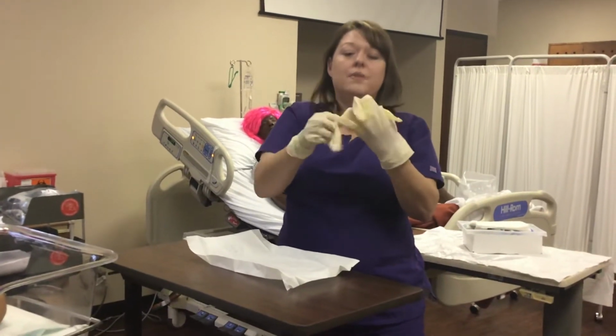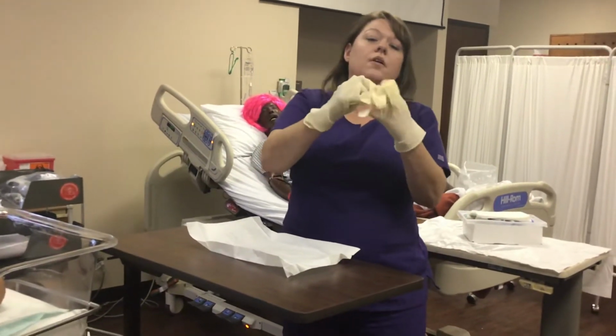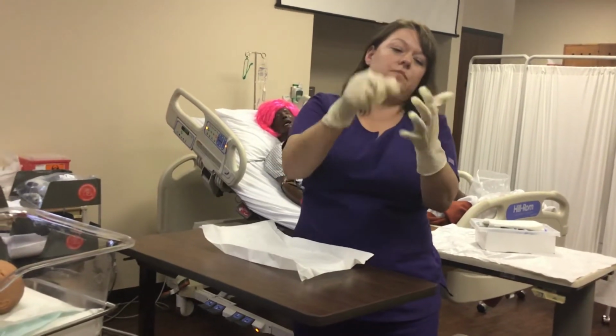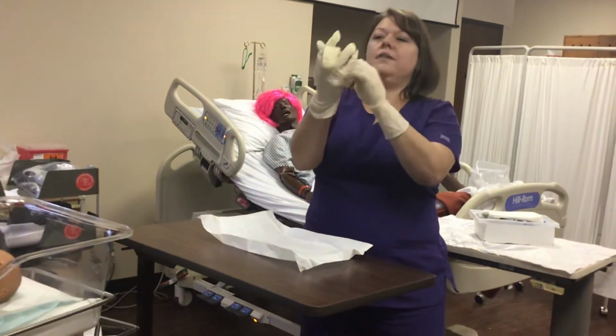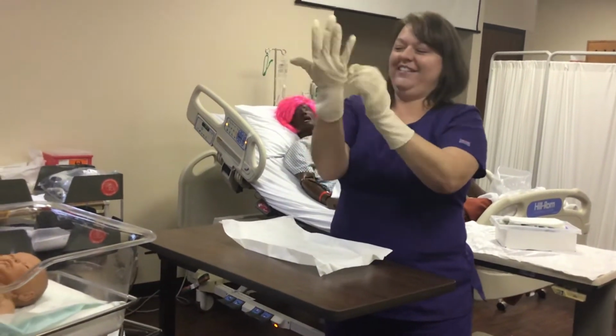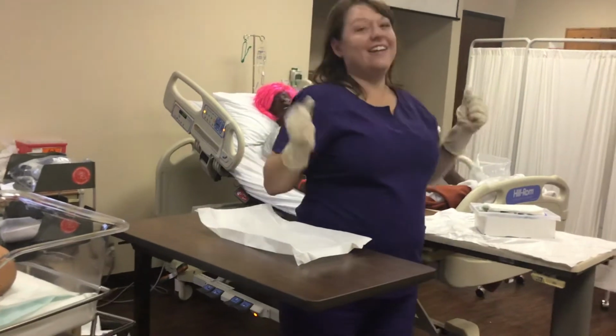And it's okay for me to touch the outside of this glove, because sterile on sterile is good. All right, now let me fix this finger. Okay. All right, now we're ready to go.